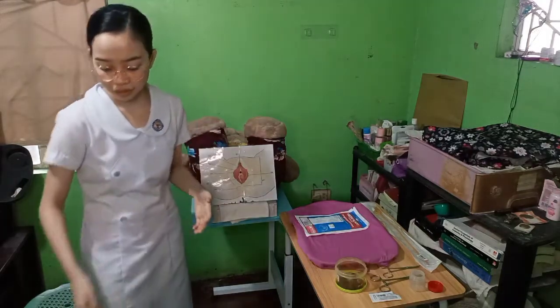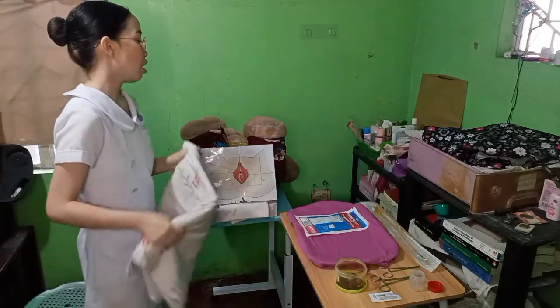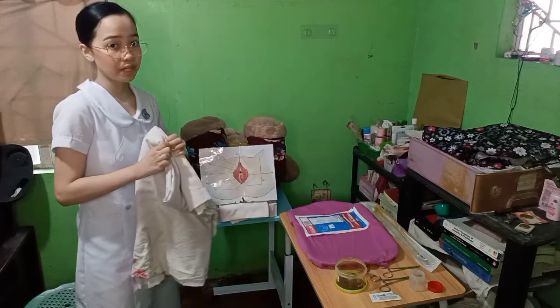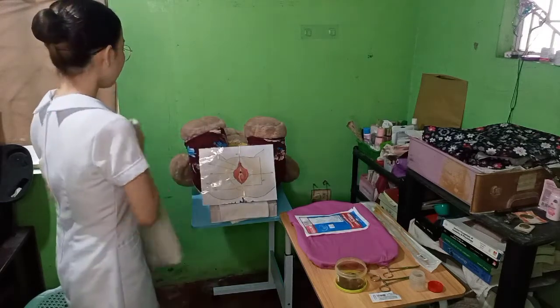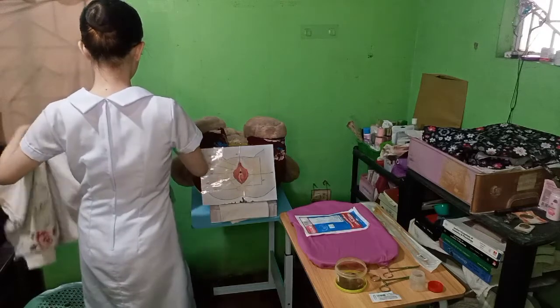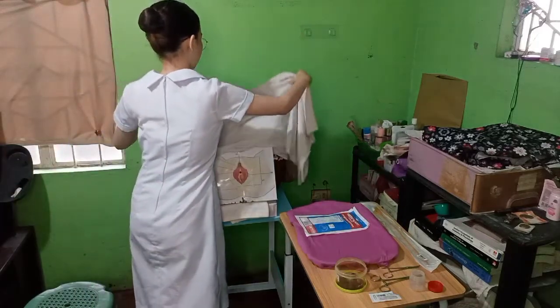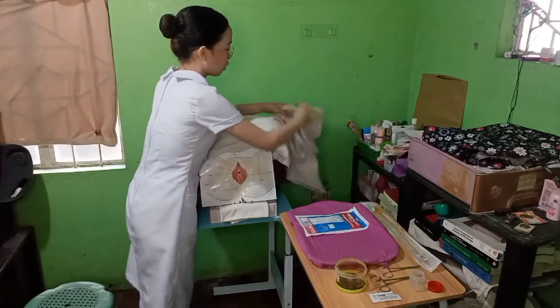And then drape the client's abdomen and thigh to provide further privacy since we will be needing to expose the client's perineal area. Ma'am, I will cover your abdomen and your thigh so that you won't feel too much discomfort throughout the procedure.